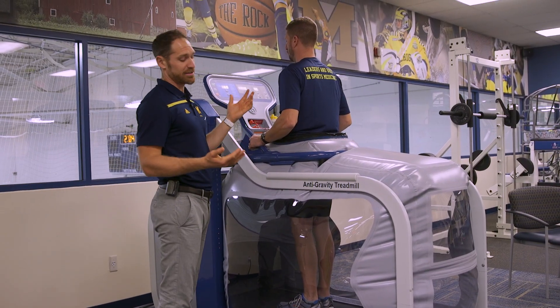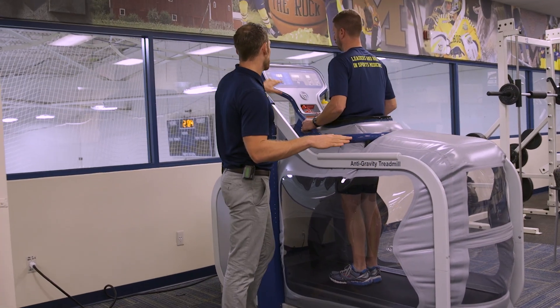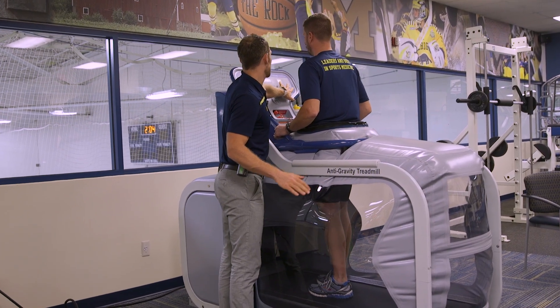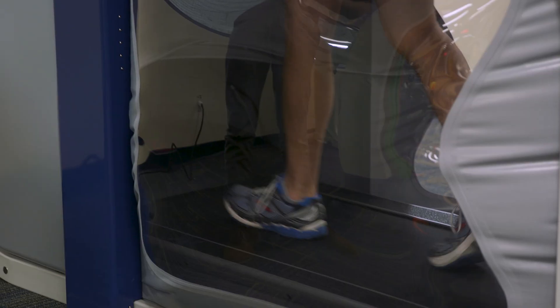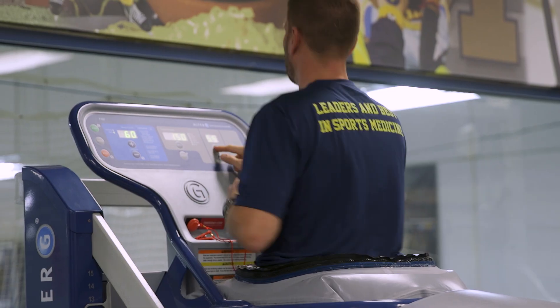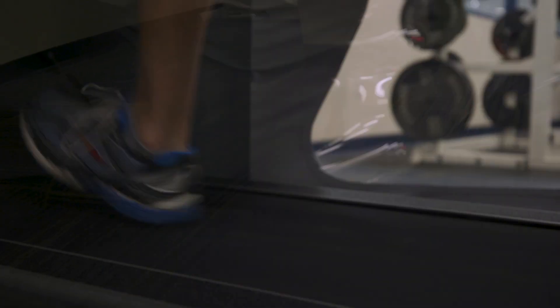We can adjust the incline and adjust the speed. We'll keep the incline level for Matt here, but we'll start by just taking him into a walk — go ahead and get into a comfortable walk, just to get used to it. Then I'll let you self-select your pace; go ahead and turn it up to what would be a comfortable jog for you. The nice thing is we have windows on all three sides, so we can take a look at mechanics, form, what the foot's doing, and what the knees are doing.